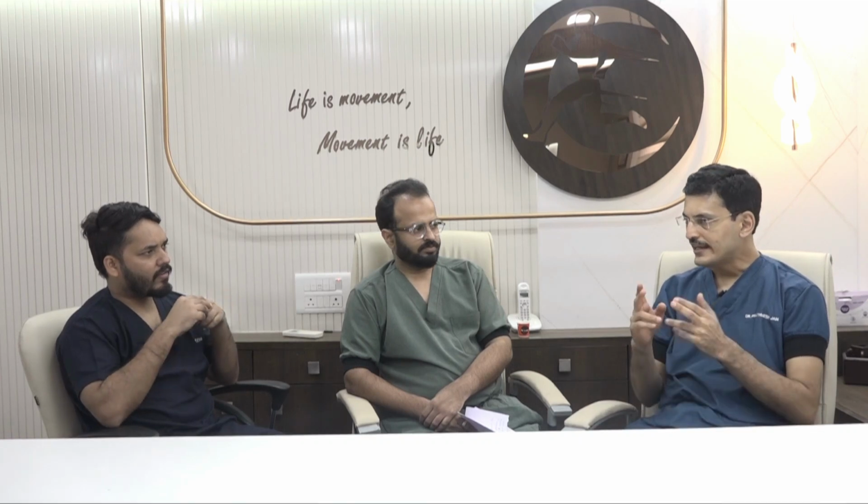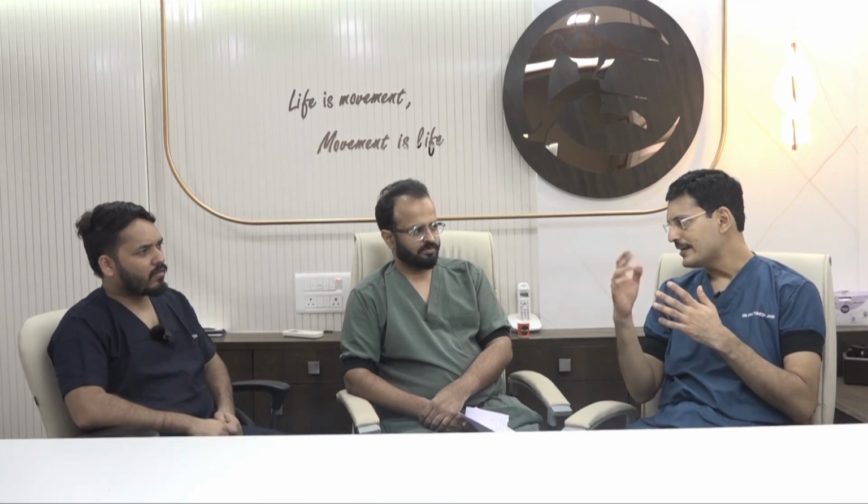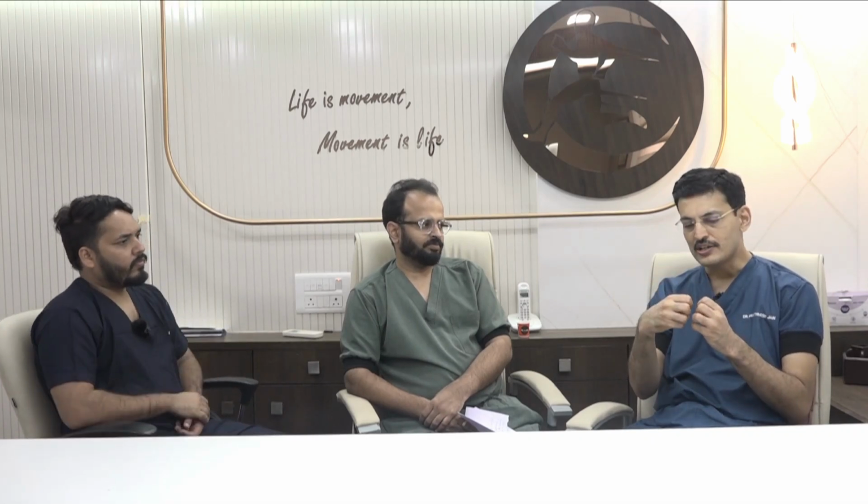Sir, in this fixation we didn't perform cycling. So cycling is an integral part. Normally I recommend cycling to be done in all the cases. But here, because of the suspensory fixation, we are removing the slack anyway. Okay. So what is the purpose of cycling? Cycling is to remove the slack in the graft and to attain a maximum length of the tendon at the time of fixation. That is basically what cycling is.